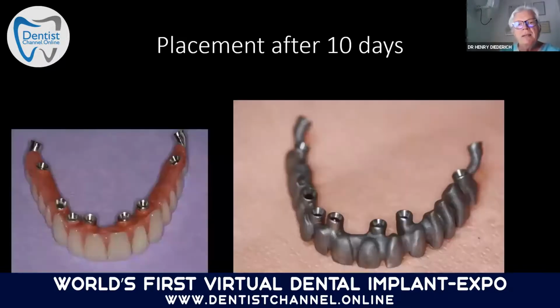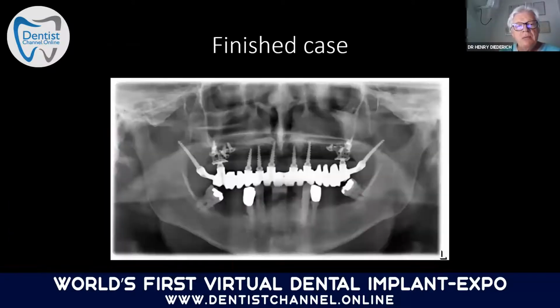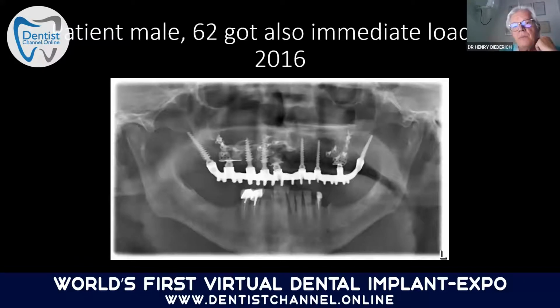We put the plate. And then after 10 days, you see, we prepared our bridge. That was a frame. And here was the finished work. And here was the finished case. So also here in a difficult case, it was possible to realize a fixed bridge after a very short time in a minimal invasive order. Or here, another patient, which also was done the same way.